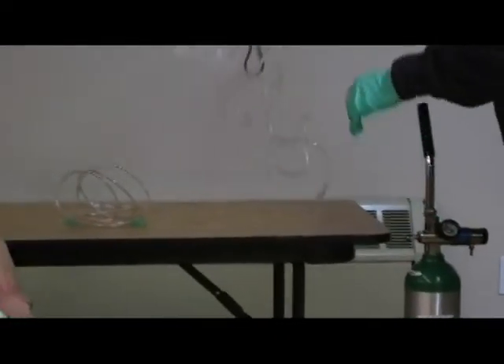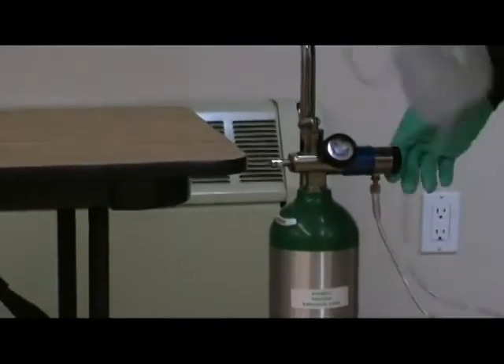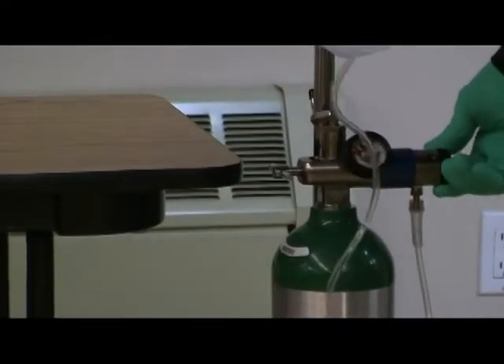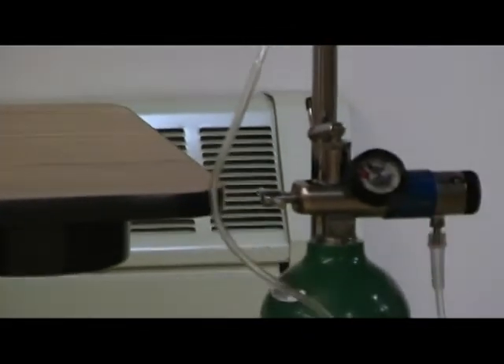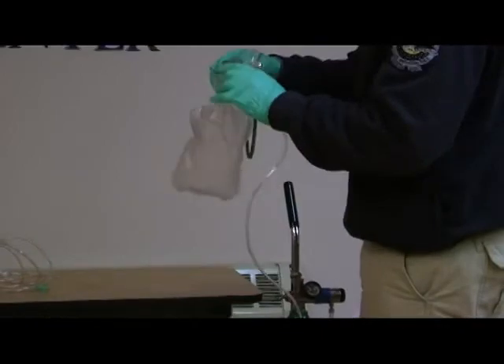Next, I'm going to attach my non-rebreather mask. I'm going to set my flow rate to 15 liters per minute. I'll make sure that my reservoir properly inflates. I'm going to attach the mask to my patient.